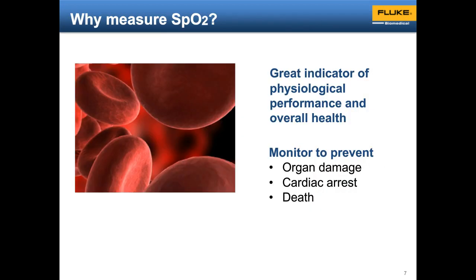So why do we measure Sp02? It's a great indicator of physiological performance and overall health because we're looking at the tie between the respiration systems and the cardiovascular system. And we monitor to prevent organ damage, cardiac arrest, death, and other adverse clinical events.